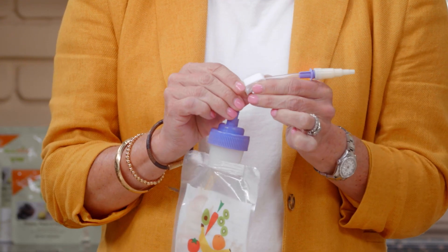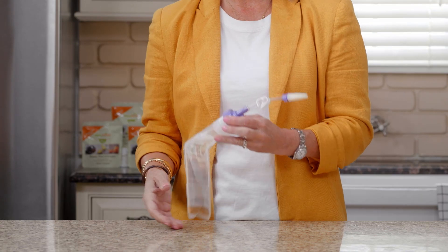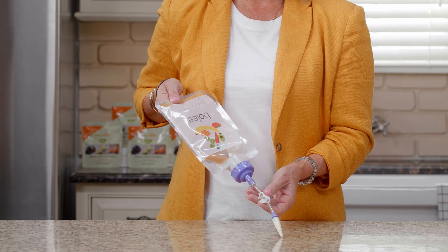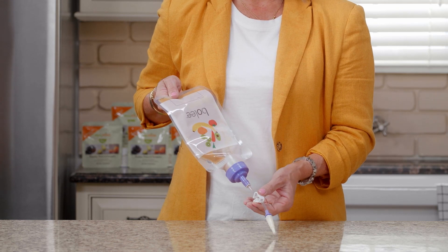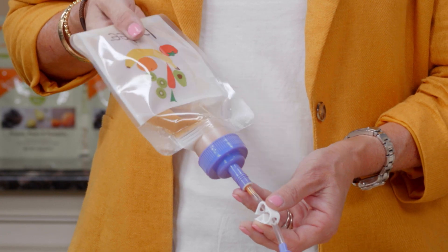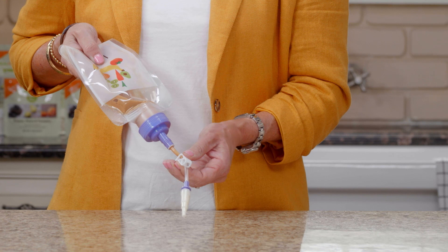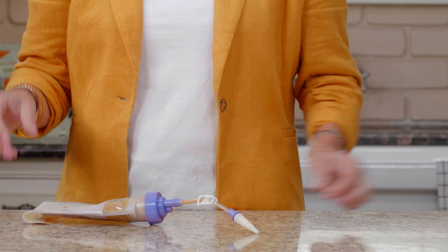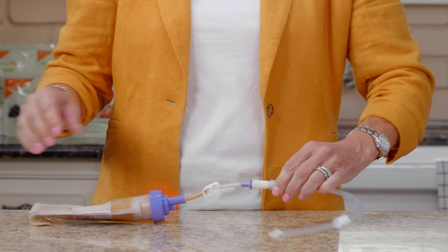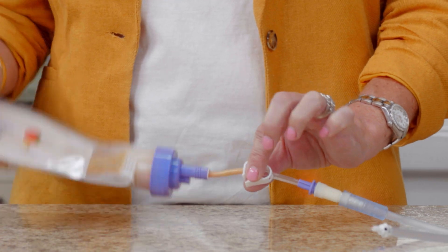Unclamp to allow the flow of real food blends to fill the tubing. Close the clamp and attach to the feeding tube. To begin feeding, open the clamp.